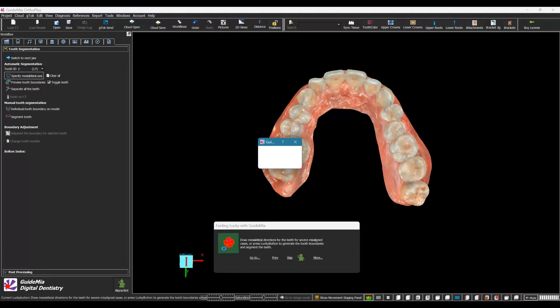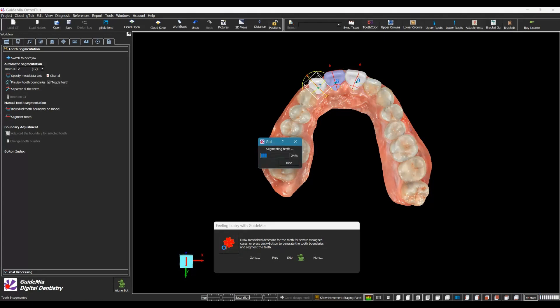At this point you can draw mesial-distal directions for the teeth for severe misaligned cases, or press the Lucky Button to generate tooth boundaries and segment the teeth. In the workflow panel's tooth segmentation page, you can set the tooth number and draw a mesial-distal axis for the given tooth. In case you want to do this for all teeth, you only need to set the first number — the system will automatically increment the number. You can draw another axis to replace an existing one, and also drag the end points after specifying the axis.